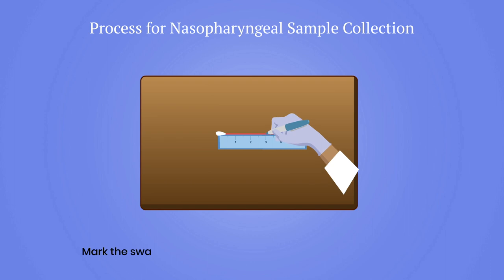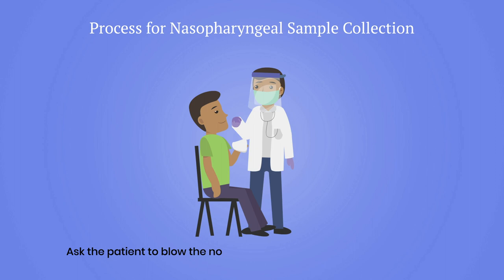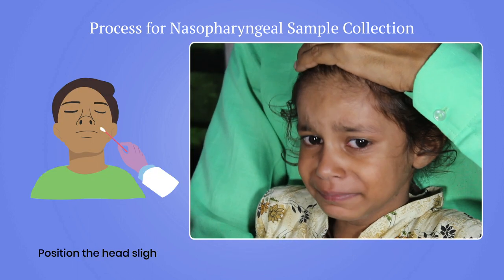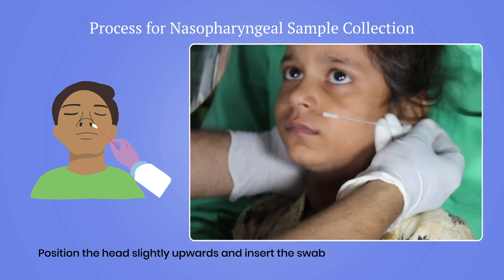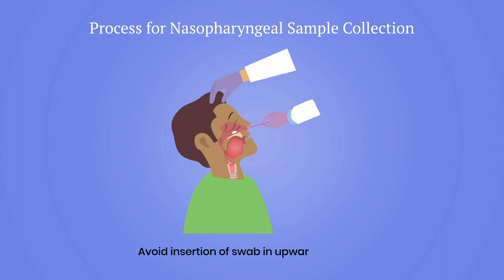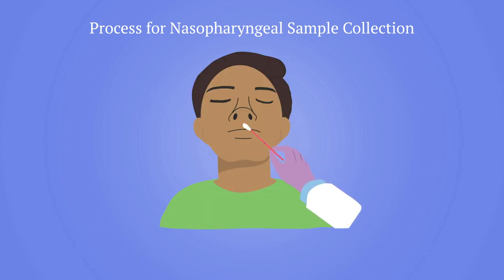Open the swab and mark it at half the distance measured on the paper scale. Ask the patient to blow the nose forcefully to remove any mucus plug. Position the head slightly upwards and insert the swab along the floor of the nose up to the distance marked. Avoid insertion in an upward direction. Do not force the swab if obstruction is encountered before reaching the nasopharynx — remove the swab and try the other side.